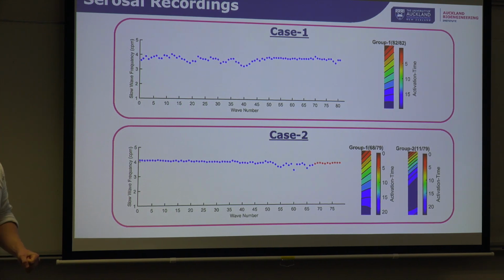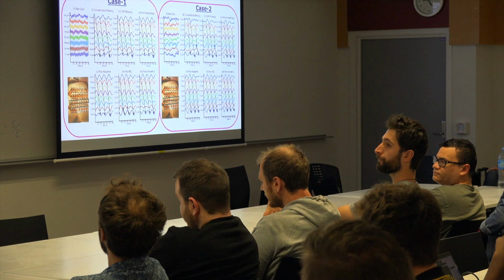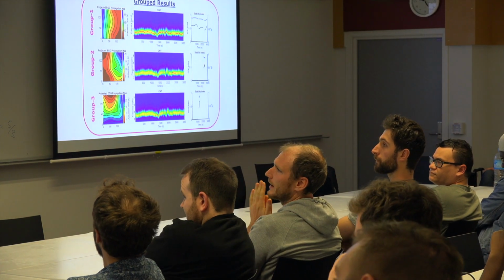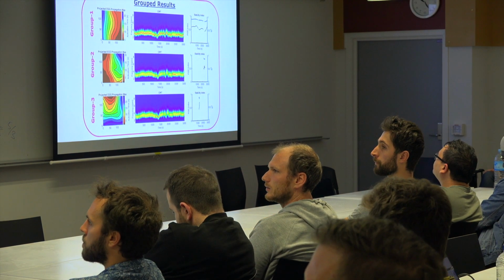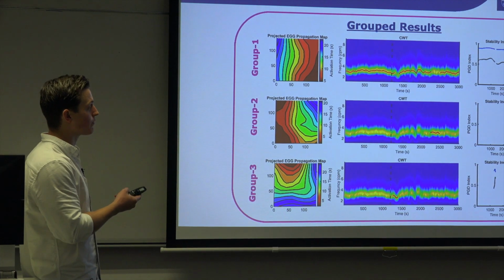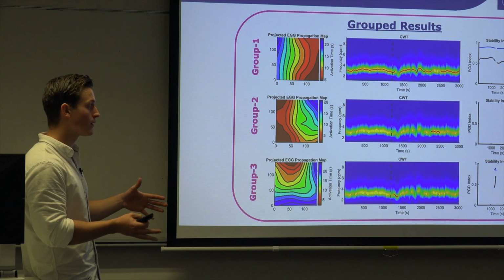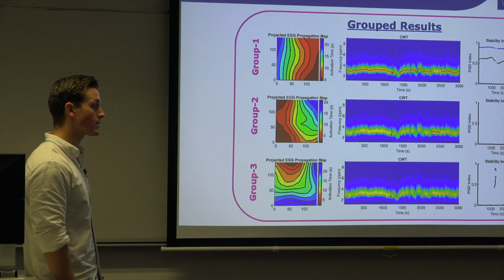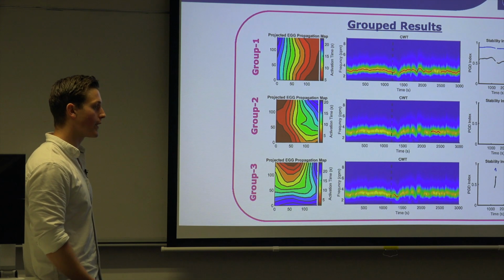Okay. My second question is, you said sometimes you pick up abnormal behavior for a certain amount of time in your human studies. Does that mean the old methods that were just looking at 3 cycles per minute were sometimes classifying people as abnormal who were actually normal and just had a brief abnormal period? They wouldn't have actually detected that change at all. They would have said that fell within the normal range, which is 3 cycles per minute plus or minus some variability, and therefore that would never have been assessed. They never looked at the directionality of that actual analysis.